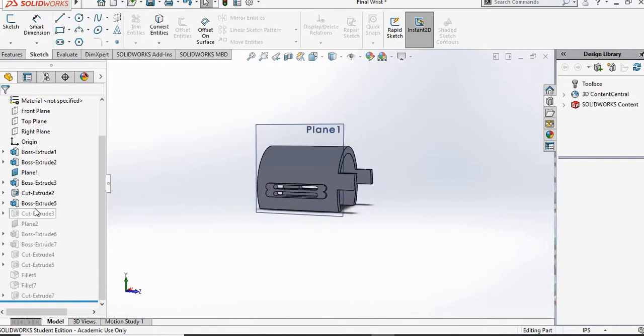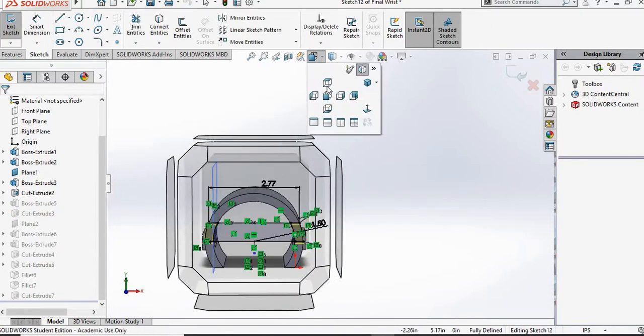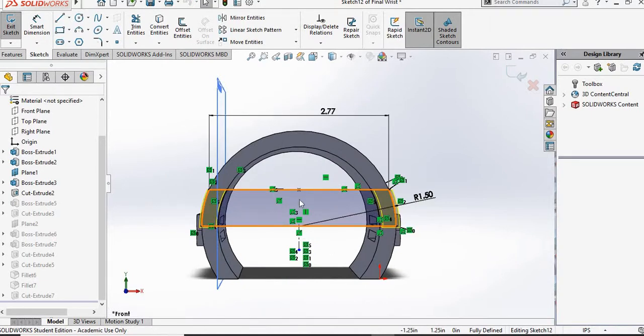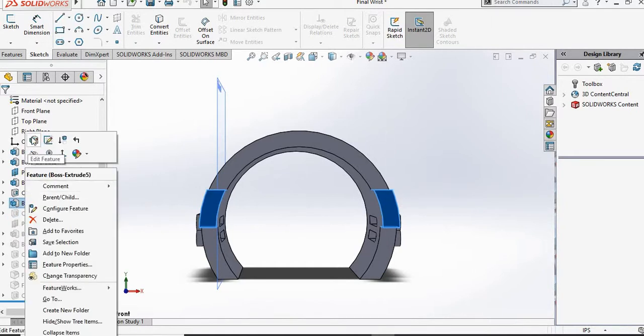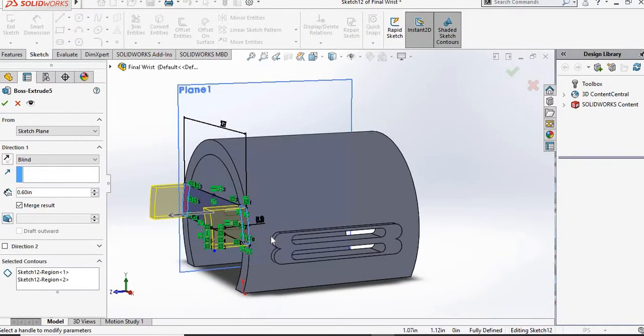Okay, and this should look something like this. Let me go ahead and show you the dimensions for that. I went to the front plane, this rectangular-ish shape that had a distance and a radius of the following dimensions, and I used the edge of our wrist bracket to fully define it. After I did that, I went ahead and extruded it, and I extruded it for 0.60 inches.